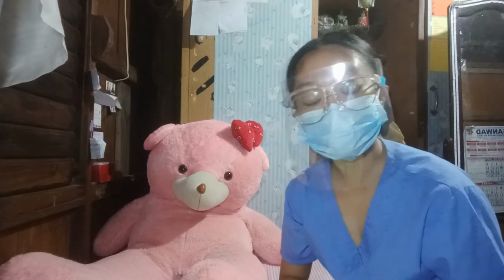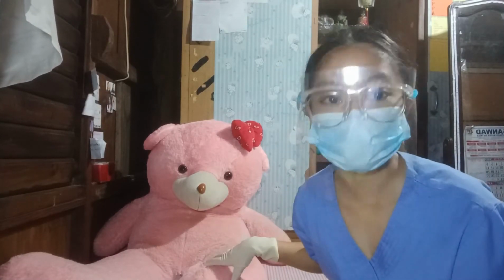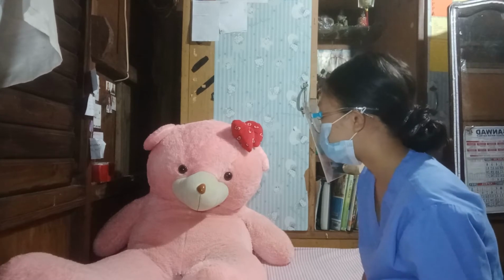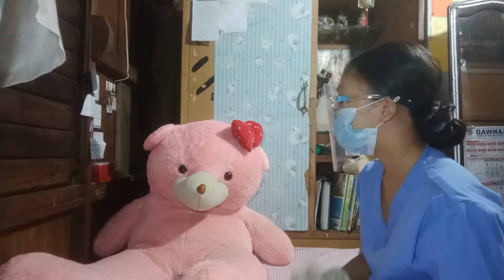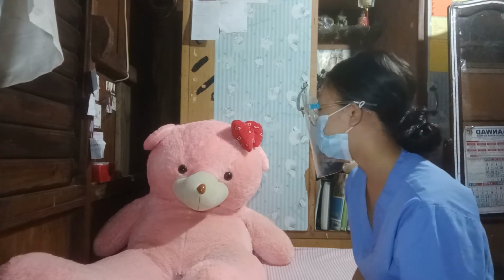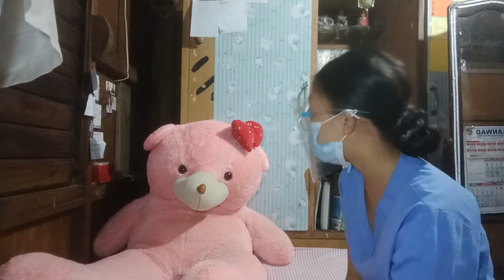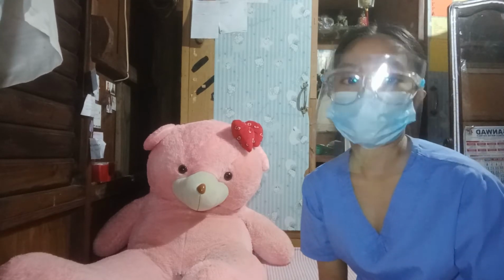Okay, so next is to explain to the significant others about the procedure. So this is Mrs. Smith. She is the auntie of the newborn. So ma'am, we are doing this procedure, the nasopharyngeal and oropharyngeal suctioning, to provide good ventilation and airway patency to your niece, and also to remove any secretions that she aspirated. So let's go to the procedure.